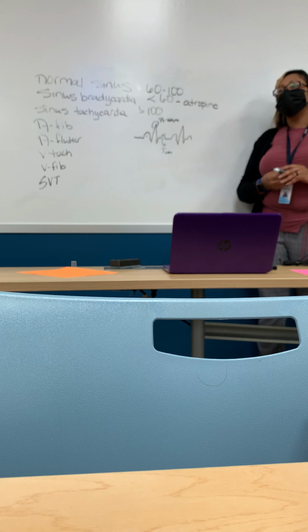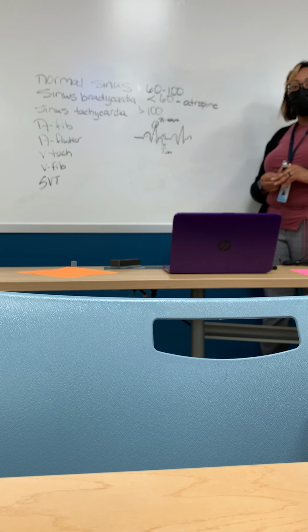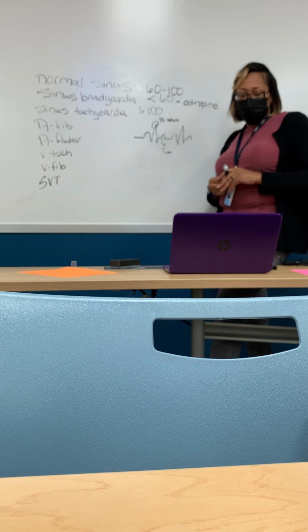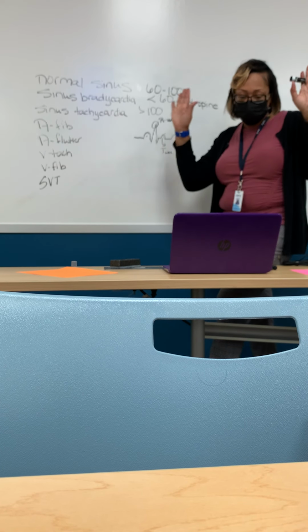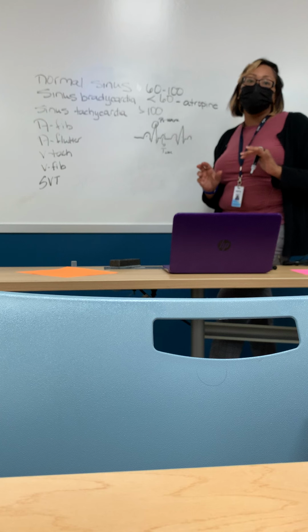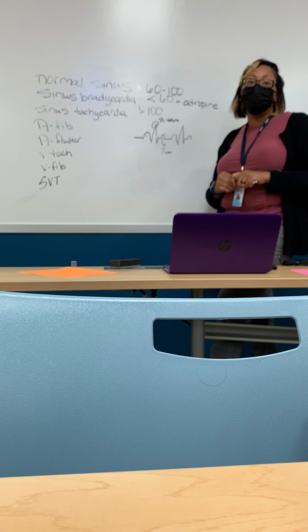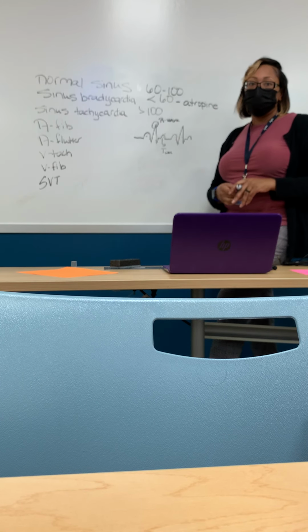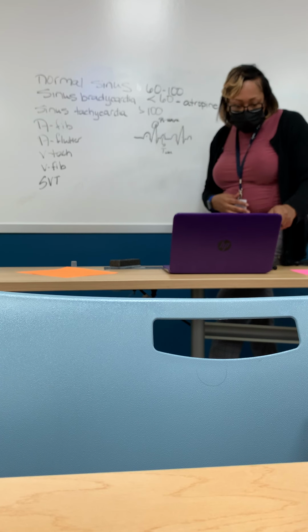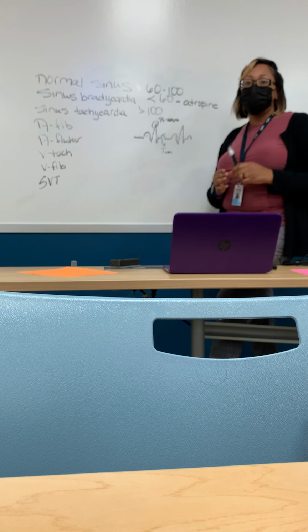Is your computer not working? No, it's loading up. 13. Why are you guys getting 14? Did you count all your R's starting at the first one? Well, I was counting the P's. No, count the R's. I always count your R's. And look for the P in front of that QRS. If there's no P there, then you don't have a sinus rhythm. You're gonna have something else. What slide are you looking at? 17.